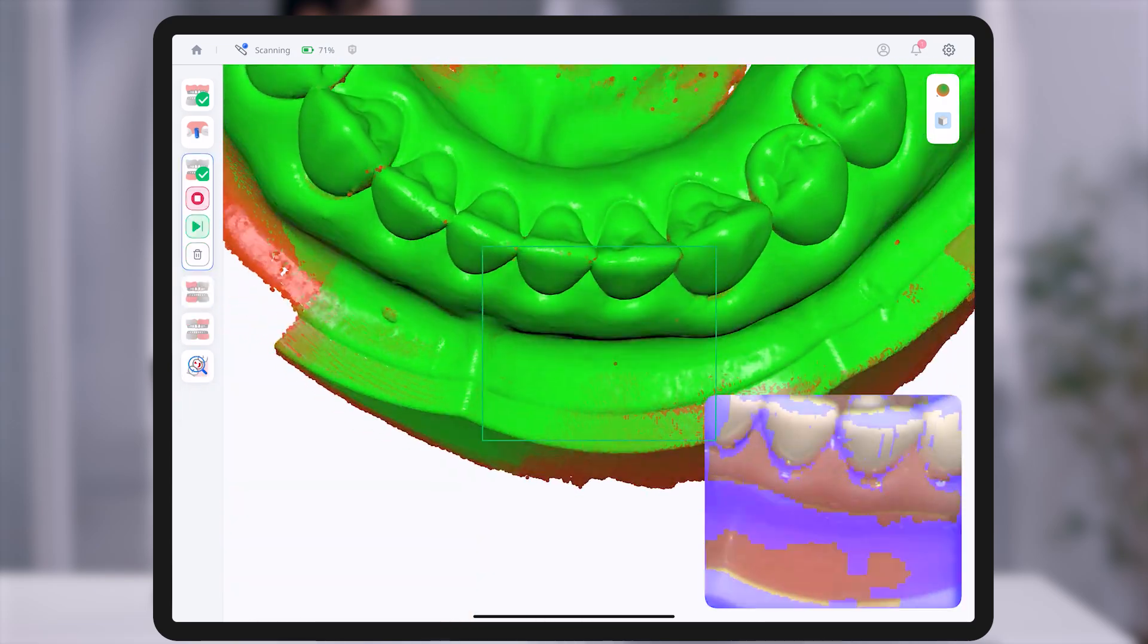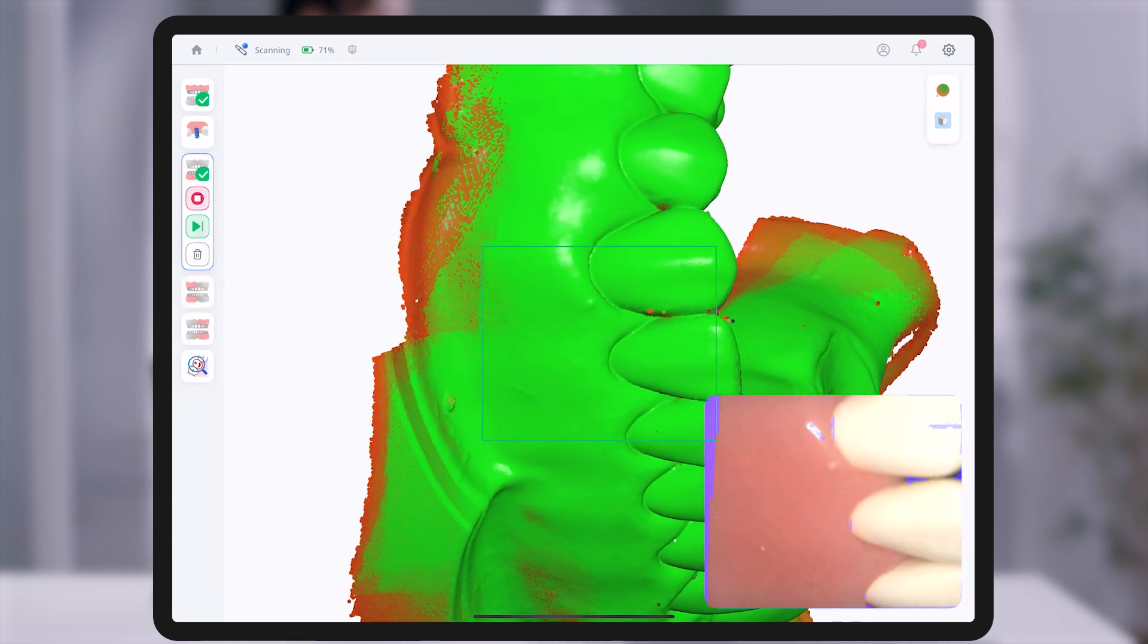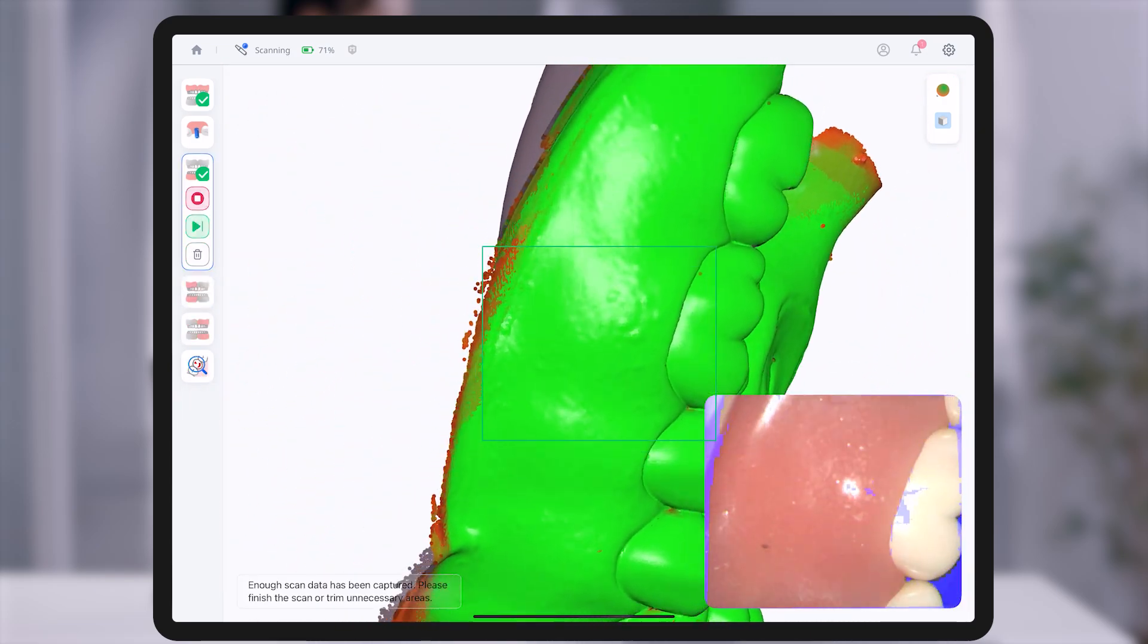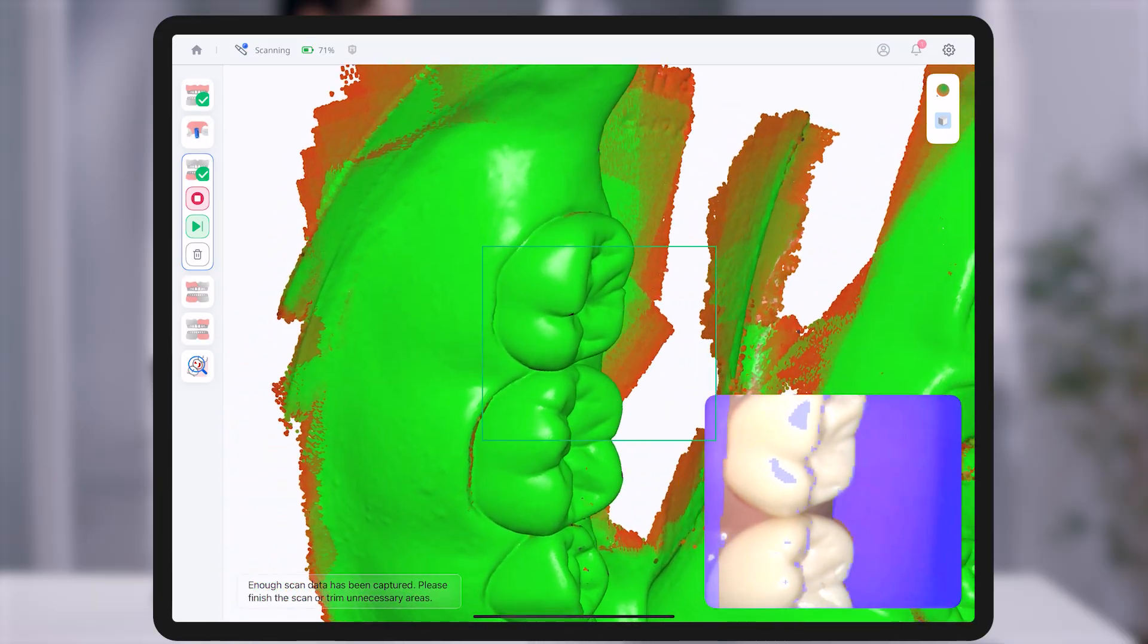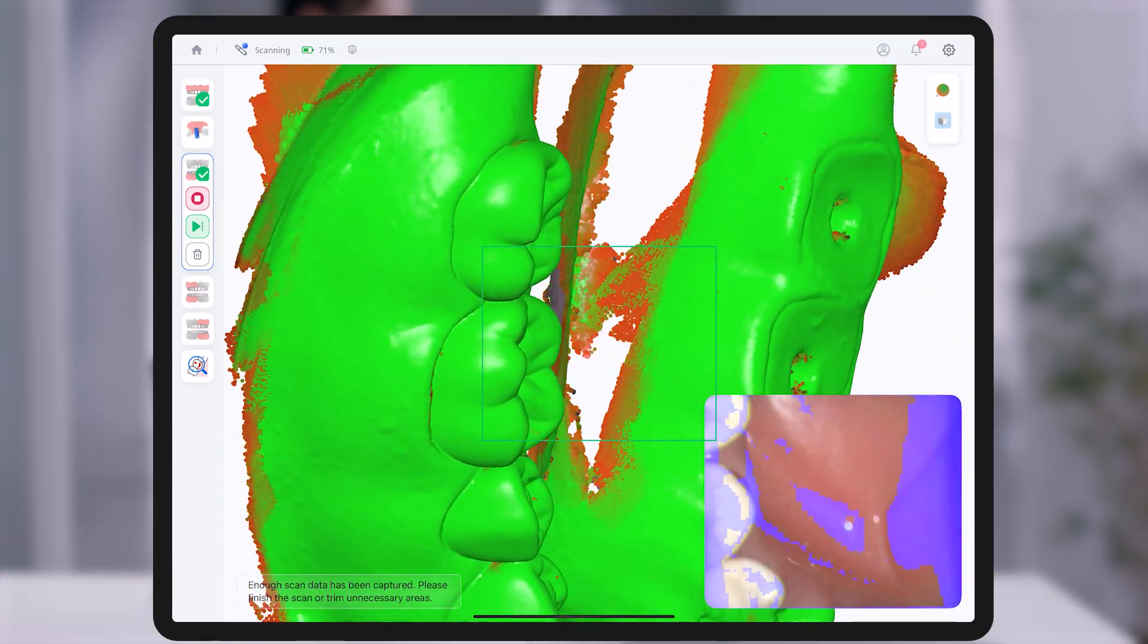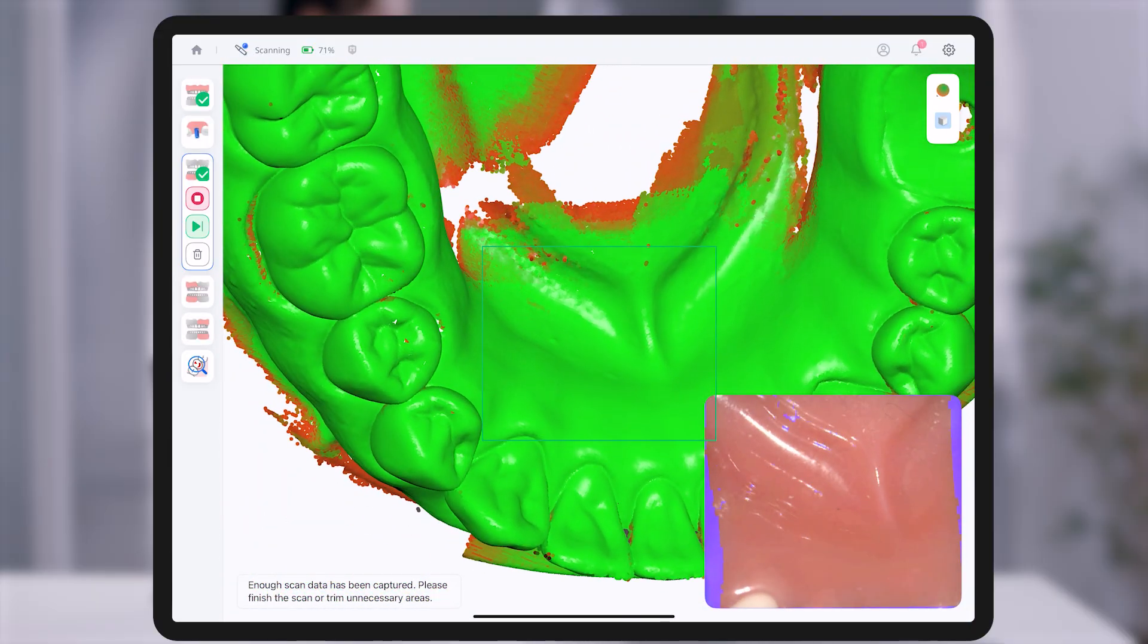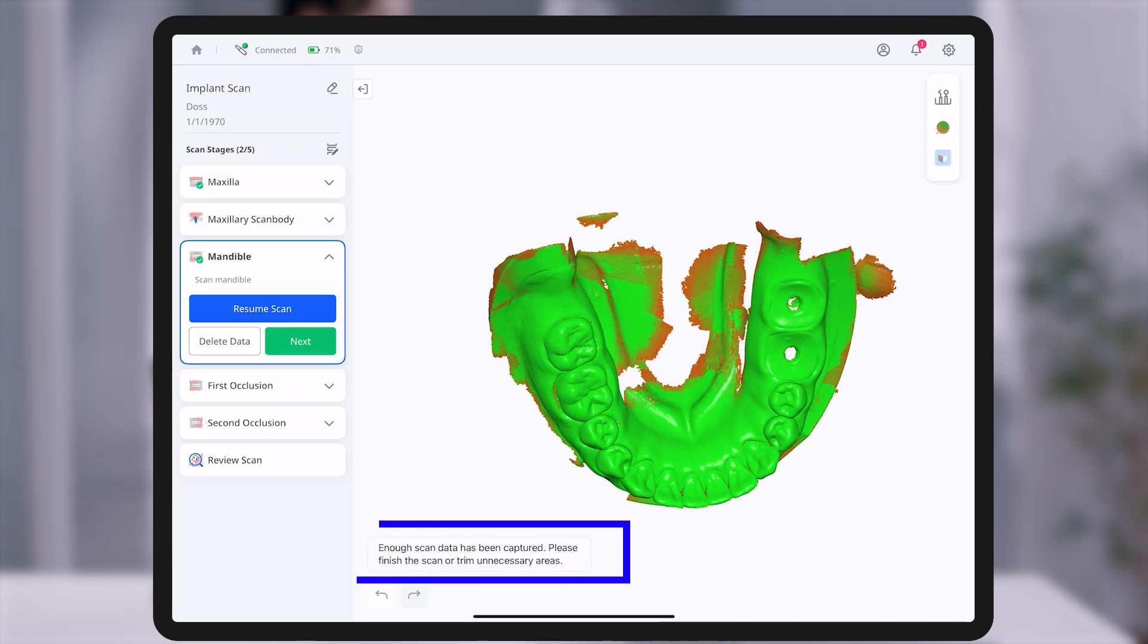Additionally, when the scan data reaches a certain threshold, a message saying enough scan data has been captured will appear. This serves as guidance that sufficient data has been acquired, but it does not mean you must wait for the message to proceed.